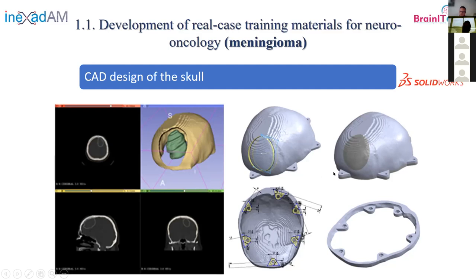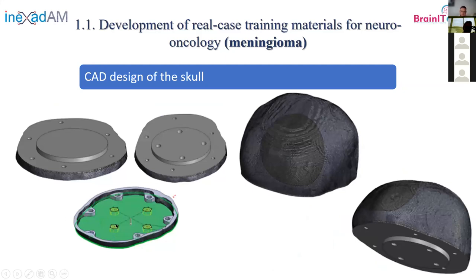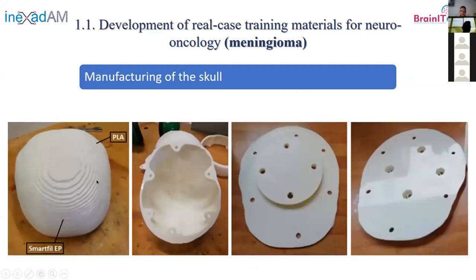We added holes for screws and other features to fix the assembly to a holder. The skull and base are screwed together, and additional holes fix the whole assembly to a holder placed on the table, allowing students to orient the skull and work on it. Here you can see the 3D printed skull and the base.